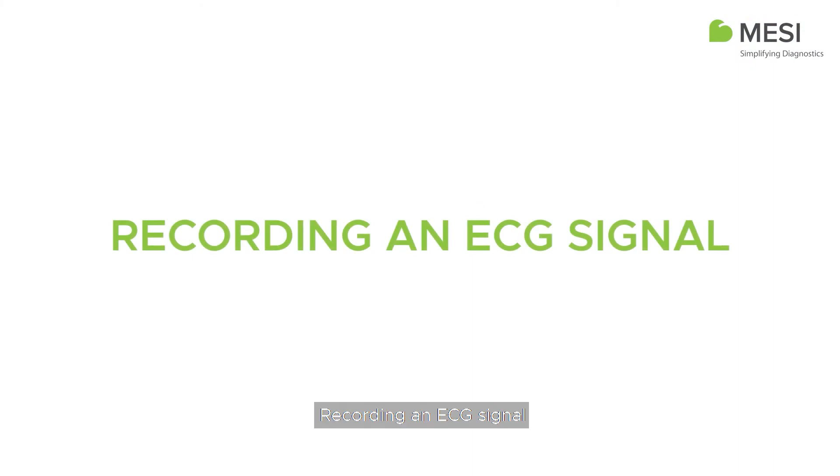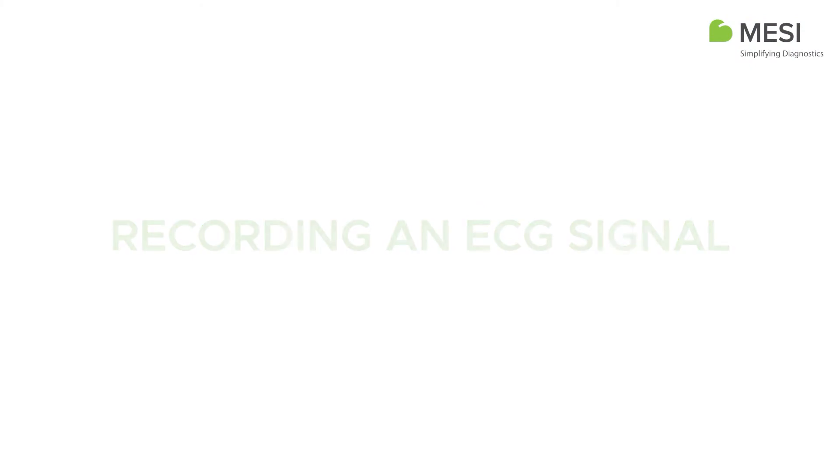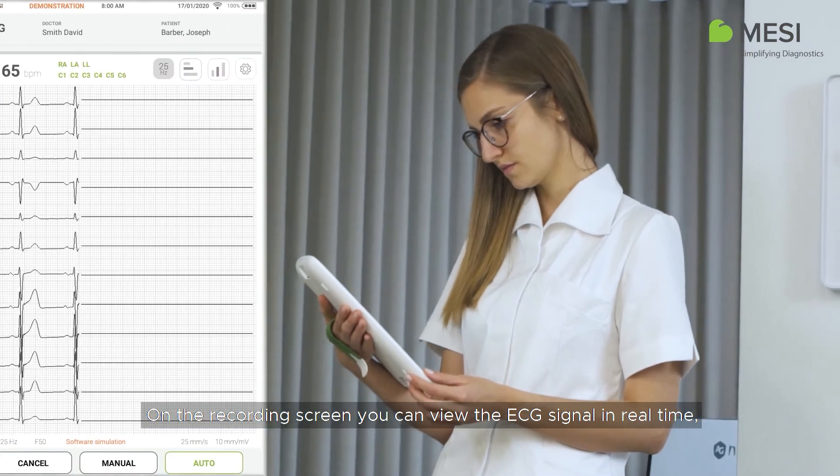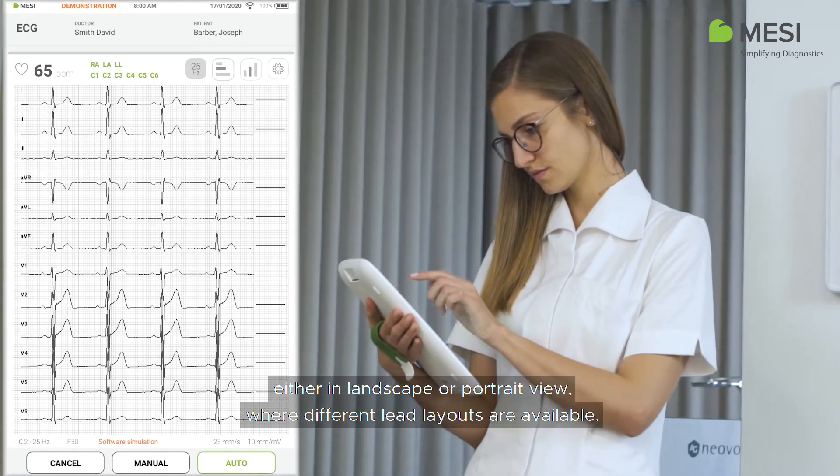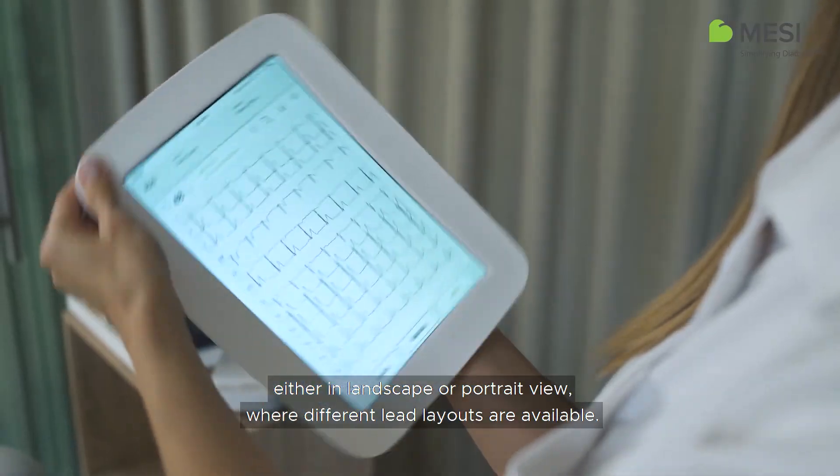Recording an ECG Signal. On the recording screen, you can view the ECG signal in real-time, either in landscape or portrait view, where different lead layouts are available.